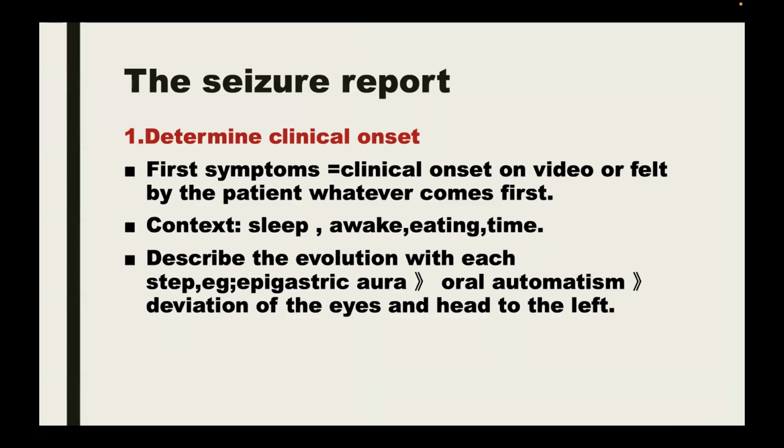Determine the clinical onset of the report. So the clinical onset, from the video or from the patient, what comes first? When we have a special event in our video EEG monitoring, we ask the patient, do you feel any numbness, any abnormal sensation, oral or visual, anything? So we must ask the patient; it is patient oriented. Ask the patient how they are feeling.